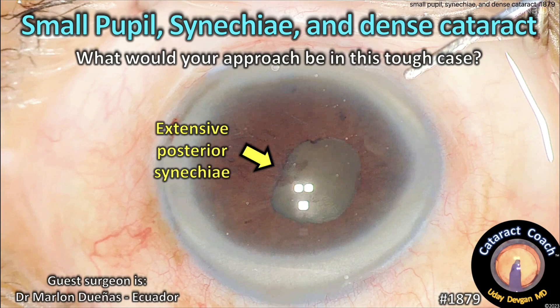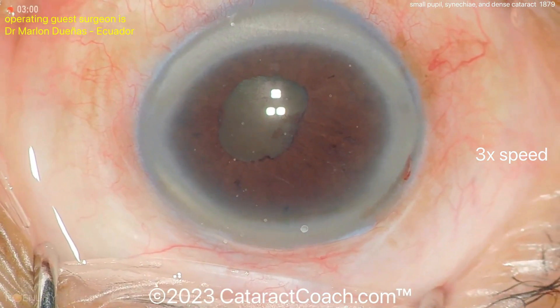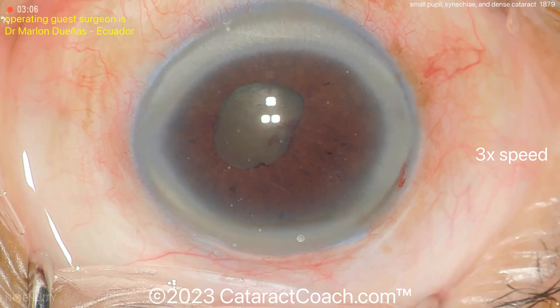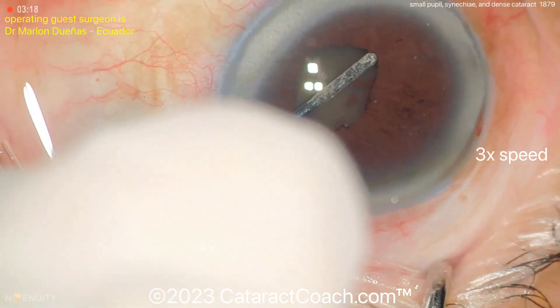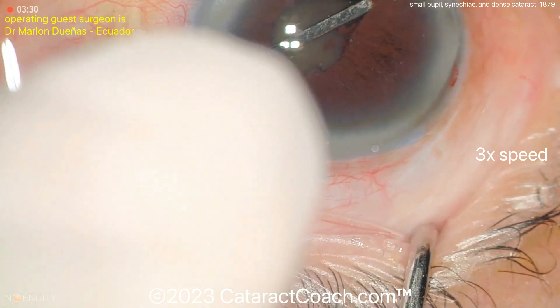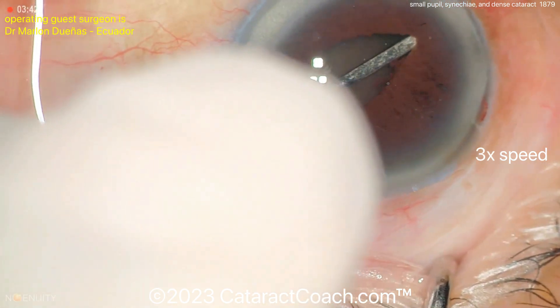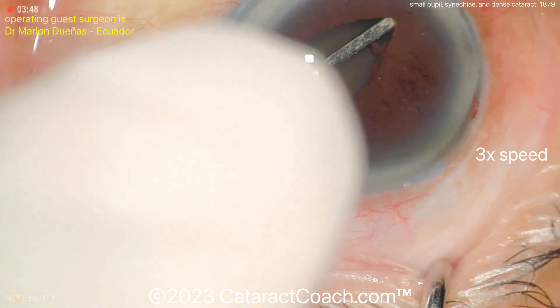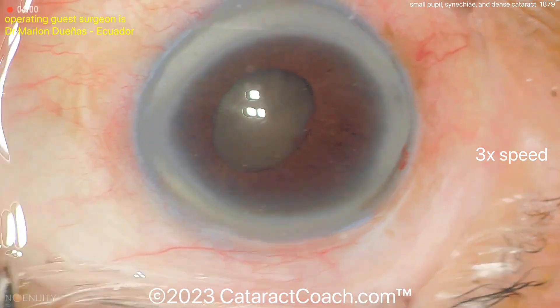From cataractcoach.com: small pupils, synechiae, and a dense cataract — what's your approach in this tough case? The video has been sped up and edited from about 45 minutes down to five. Using a spatula with a little viscoelastic in the eye, gently sweeping to break the synechiae that are adhering the iris to the lens capsule.